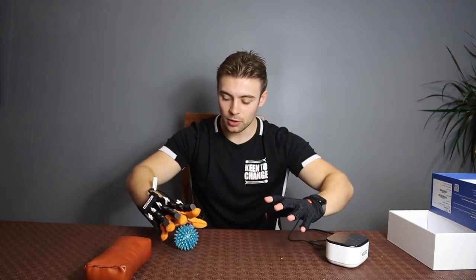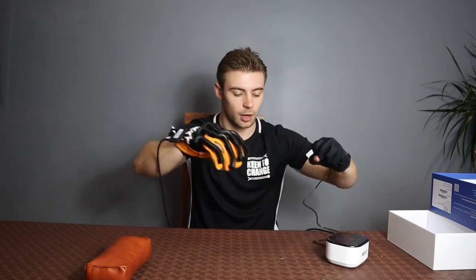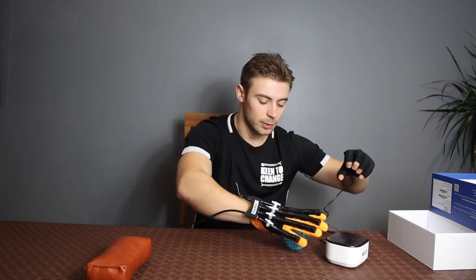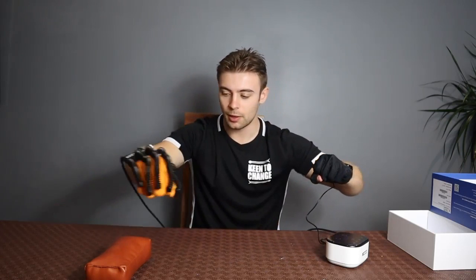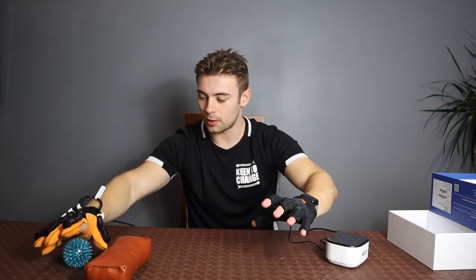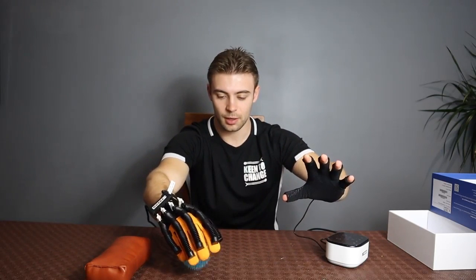What we can actually do is start to train the injured hand. I've got my hand open here and I'm just going to mirror this movement and pick this up and place it over here. As we can see, I'm going to mirror this movement, moving it from side to side — close and open.